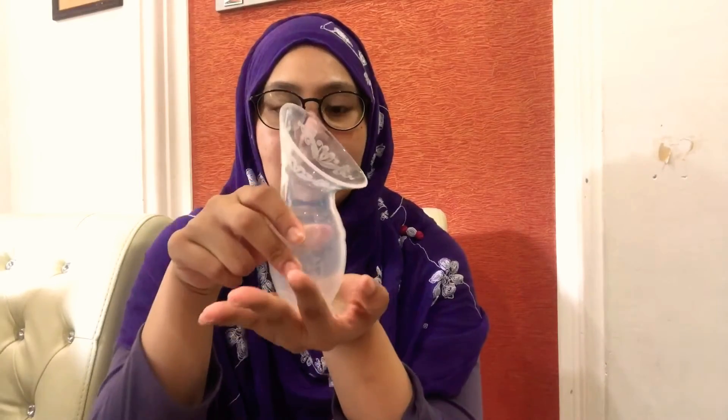Apart from that, the Haakaa has a suction base on the bottom, so after you pump you can place it on the table and it will stand still without tipping over. The Autumn doesn't have this feature. The Autumn does work, but the opening size and the quality of the silicone feel too cheap to me.